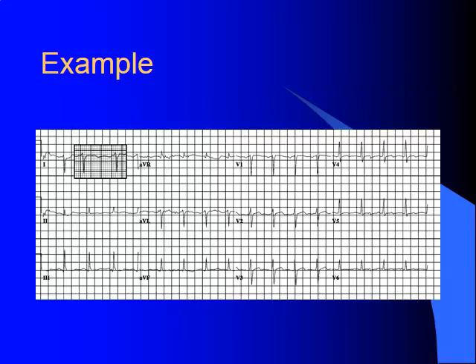We have a small Q wave in lead 3, and we do have right axis deviation. A quick test to see if you guys remember here, if you have your cheat sheets handy. Let's go ahead and determine our axis on this particular EKG.